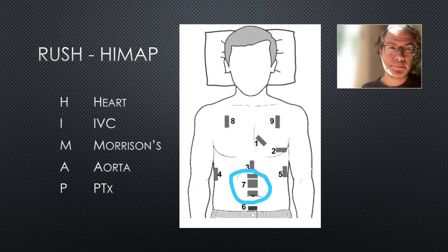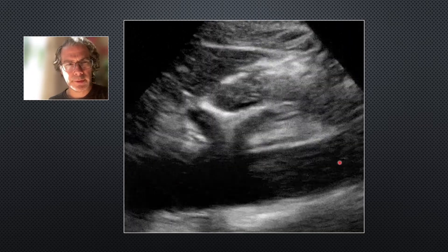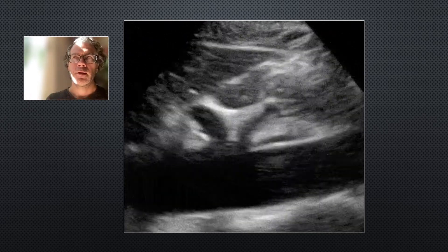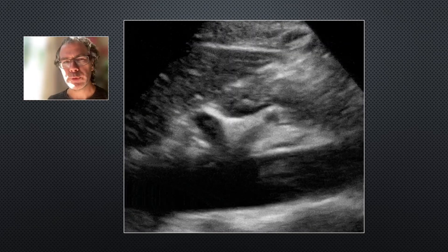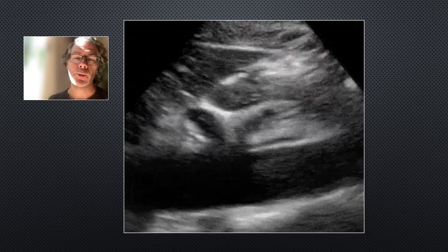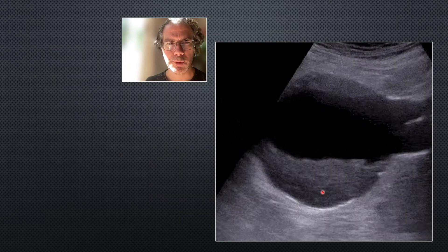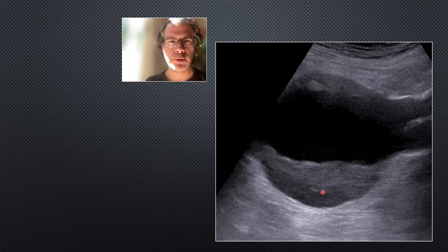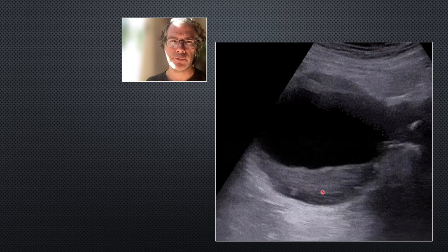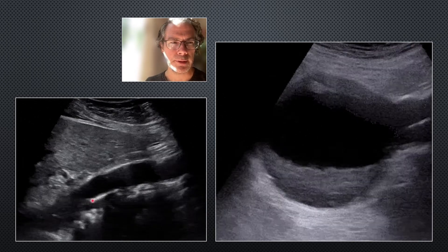Here's an example of an aorta in long axis from head to feet, showing the celiac trunk and SMA. A normal aorta is two centimeters in diameter. If you can see the whole abdominal aorta at normal diameter throughout, you rule out a AAA. However, if you do see a AAA, ultrasound cannot tell you whether it's ruptured — for that you need a CT. A big AAA with clot within the wall in a patient with shock would make you very worried about rupture. Also keep an eye out for a dissection flap in the aorta in long axis.